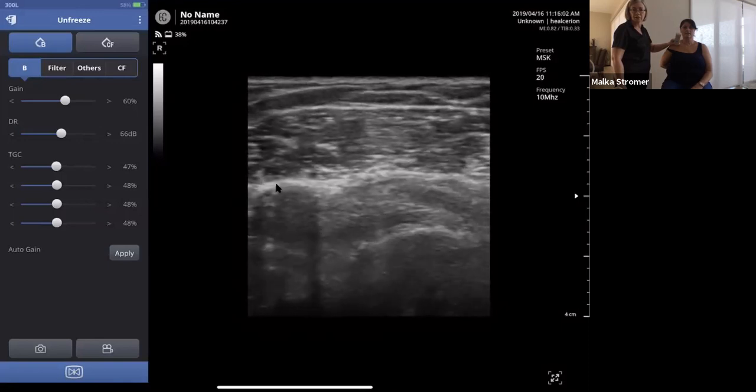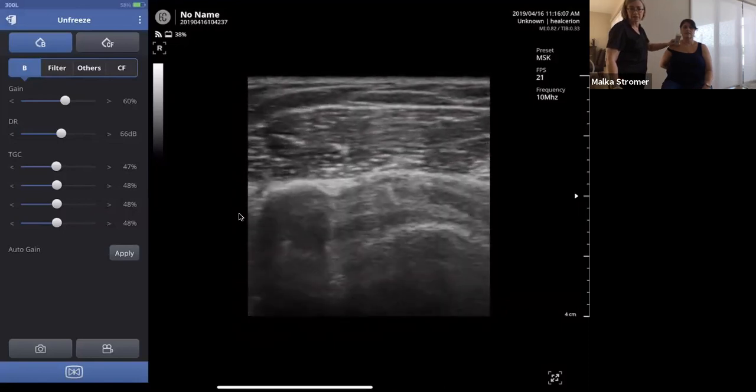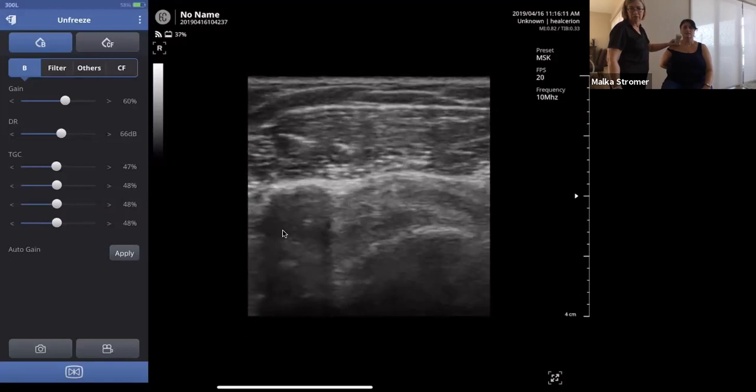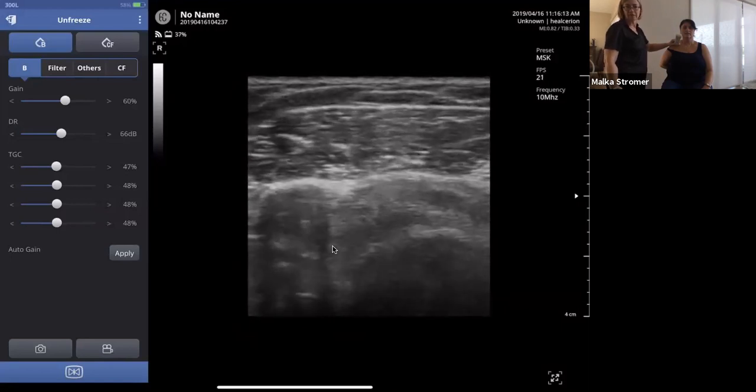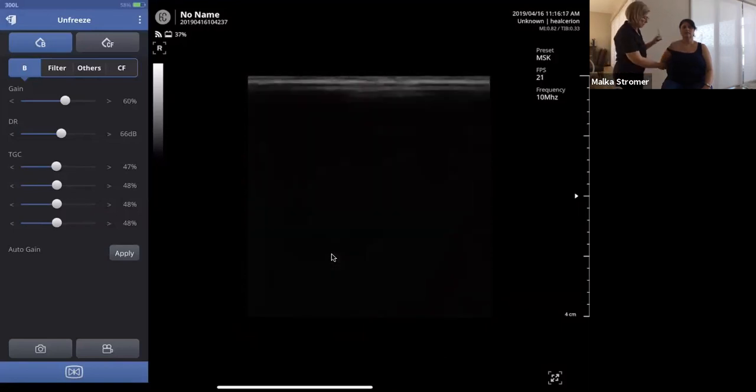Humerus along the bottom, tendon above that. Coracoid off to the left. And biceps is down in the corner, a little to the right there. Right down in there is the biceps tendon. This way you know you're in the correct position. Okay, I'm going to come back out, hand across the body.